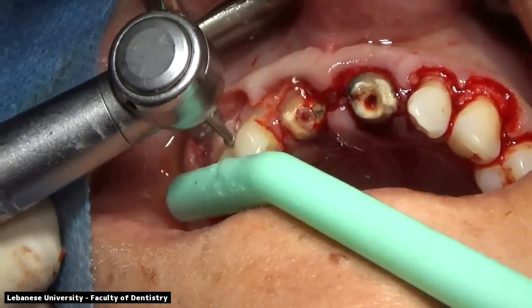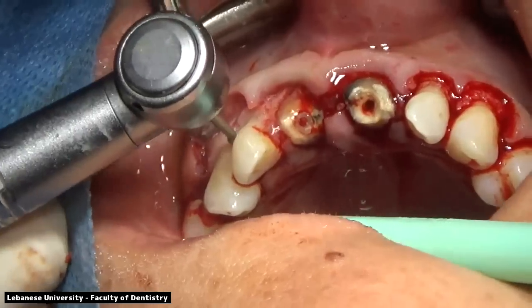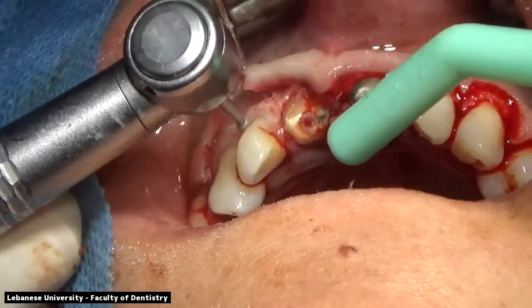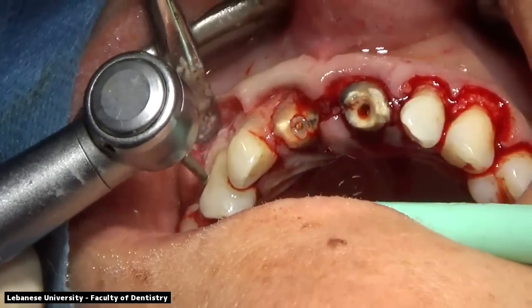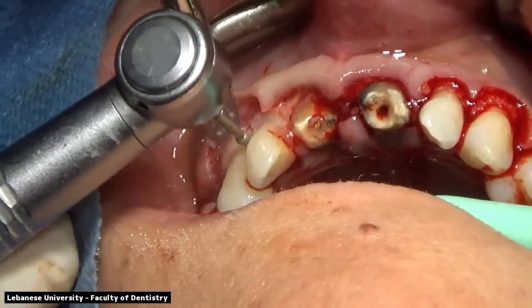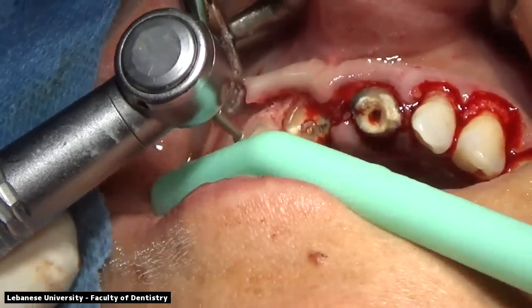So we have to open a full mucoperiosteal flap and adjust the bone levels around the lateral and the central, around the lateral and the canine. The bone levels will be about 2 millimeters below the cementoenamel junction, going from the mesial side to the distal side, all around those teeth.